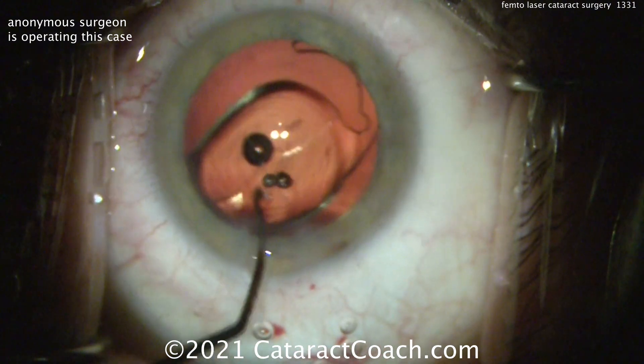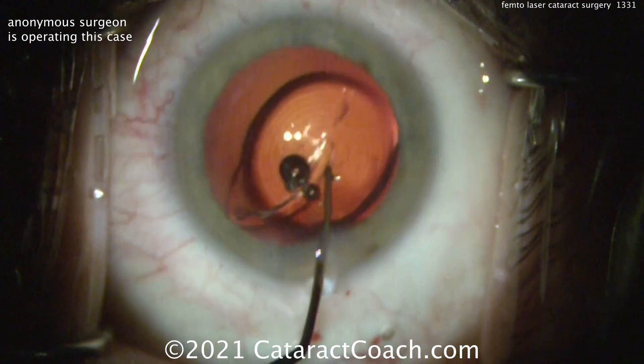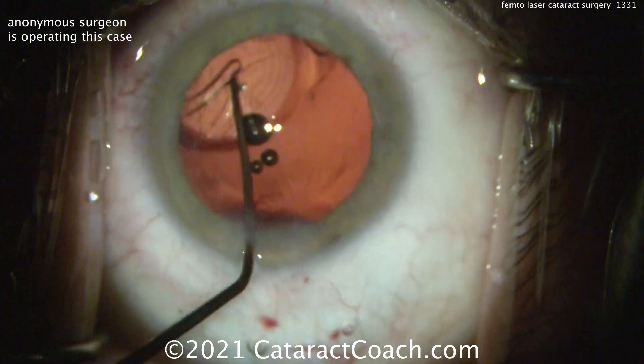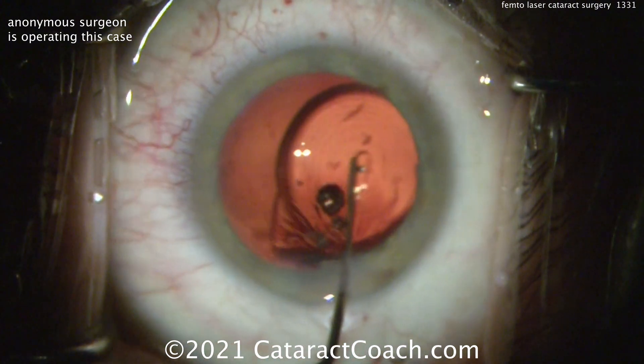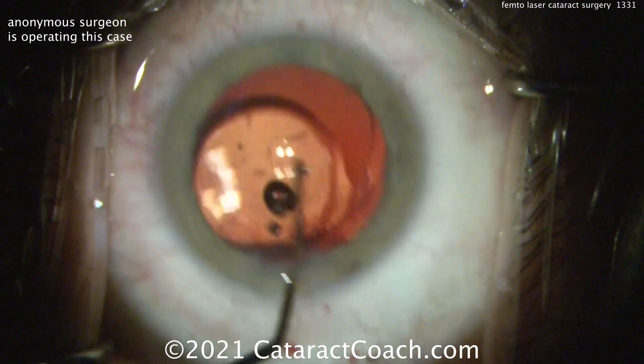Now here's the lens going in the eye. It looks like it's a diffractive — perhaps multifocal — lens. Looks like maybe it's a Tecnis family of lenses, so maybe a Tecnis multifocal or perhaps a Tecnis Synergy lens. Getting that trailing haptic to open up, and that looks great.